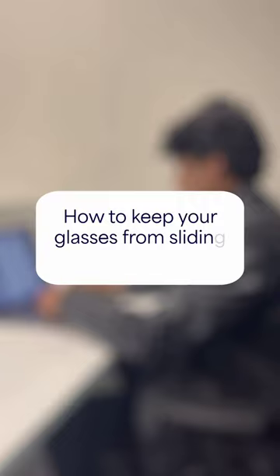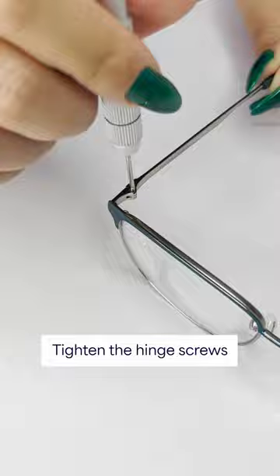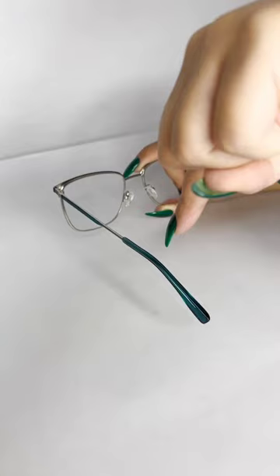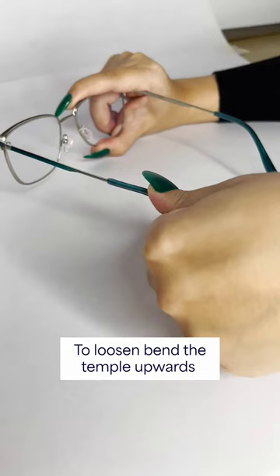How to keep your glasses from sliding off your nose. Tighten the hinge screws. To tighten, bend the temple downwards. To loosen, bend the temple upwards.